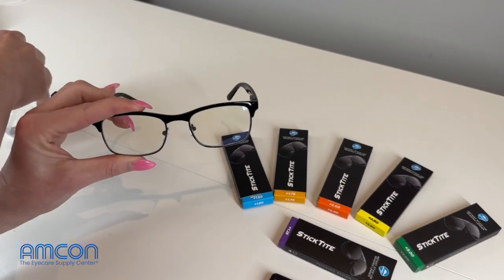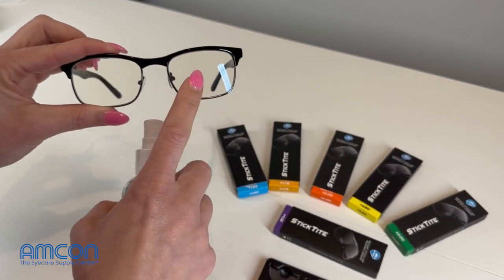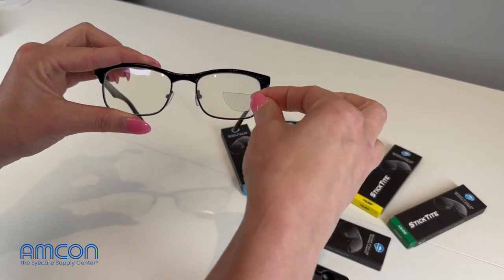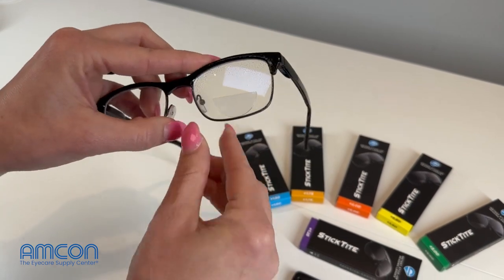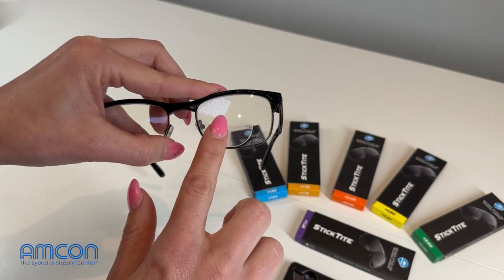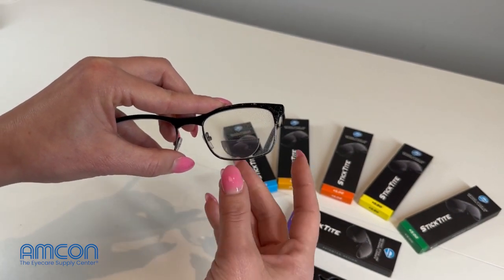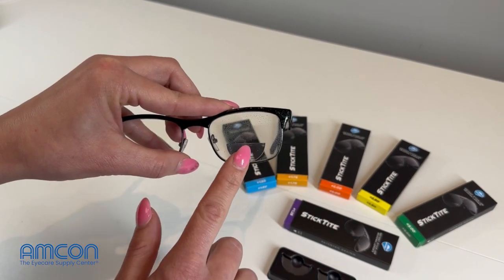We've already done that in this case, and then you do have to make your lenses wet. We're going to use our AR Clean Lens Cleaner for this purpose — water is fine as well. So you just want to go ahead and spray your lens like so, pick your Instant Reading Lens up and put it onto the lens itself. It does take a couple of minutes for this to set, so you do have the option to move that lens around until you get it exactly where you want it to be, where it's going to fit that patient. Then you just kind of want to gently press out the air bubbles.